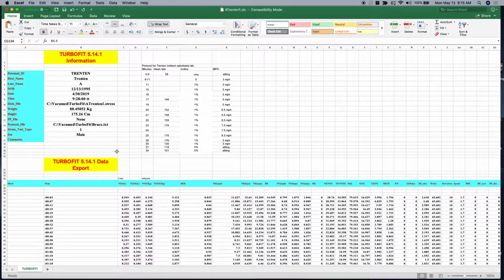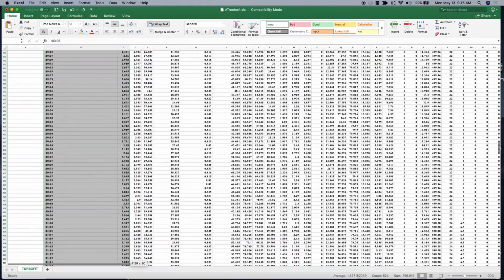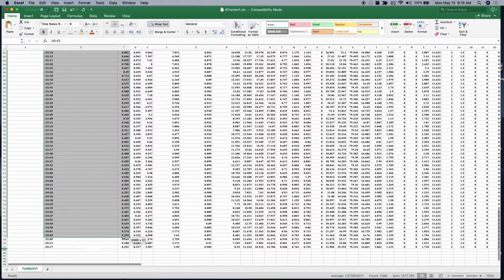And this is what I want in your lab report. So for example, if you wanted to graph total VO2 consumption across the entire time span of the test, which is a graph that you should consider making for your lab report, what you do is just highlight this entire row, and you can see there were 730 data points, so it's going to be quite a bit of data. But if you highlight both these, now remember the far left-hand column is going to end up being your x-axis, and then the y-axis is going to be VO2 in liters per minute.